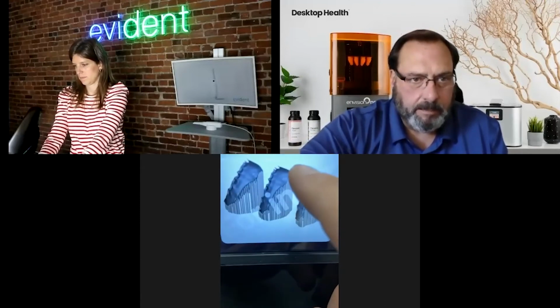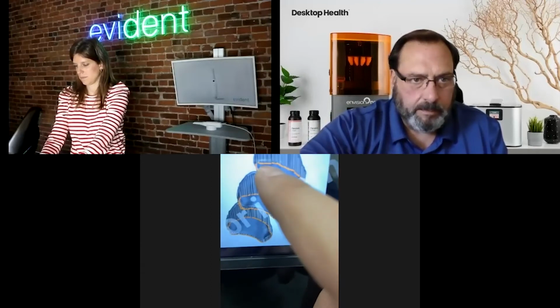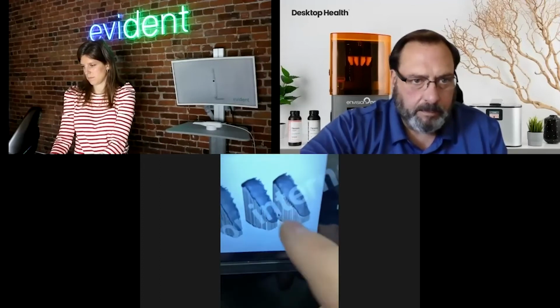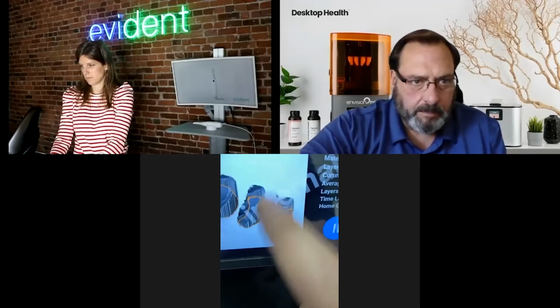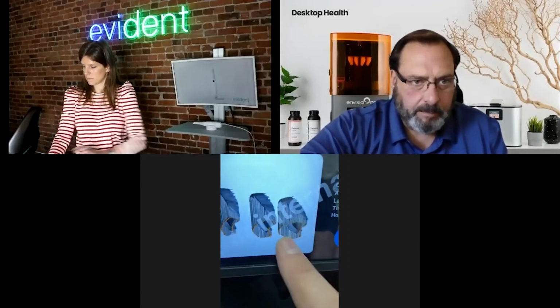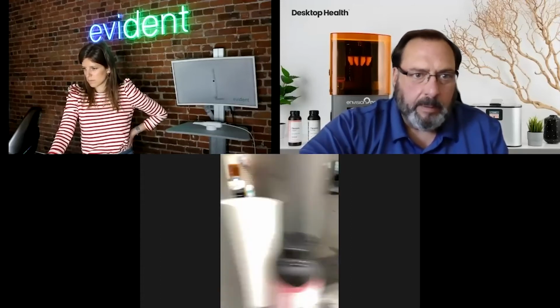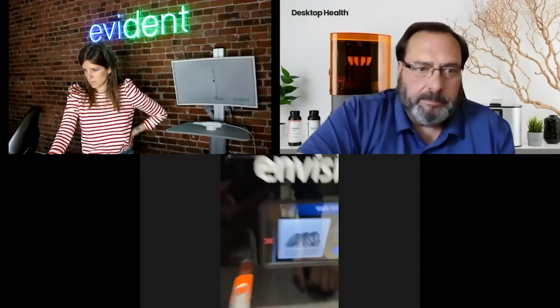So it automatically supports just the border. That way the patient fitting part doesn't have any polishing, any finishing. And since when you're going to fit the denture in the mouth, you're going to touch up those edges anyways, you're not really adding supports to any parts that you're going to be worried about fitting in the future. So you set that up. This entire setup takes you maybe, I would say, 15 to 20 seconds in the software.